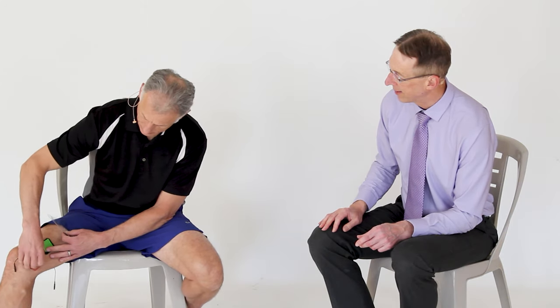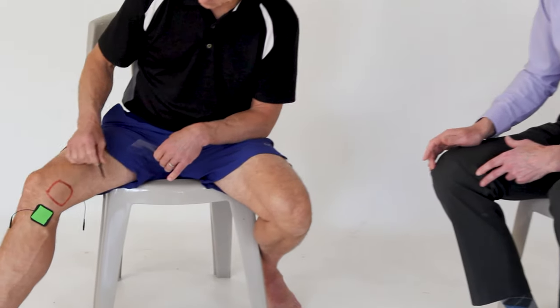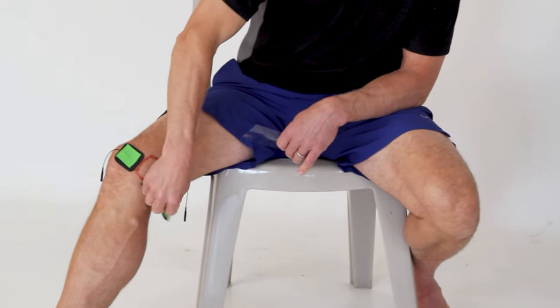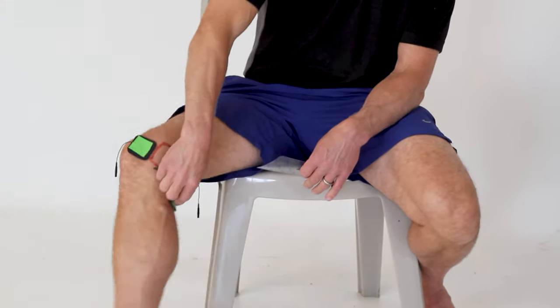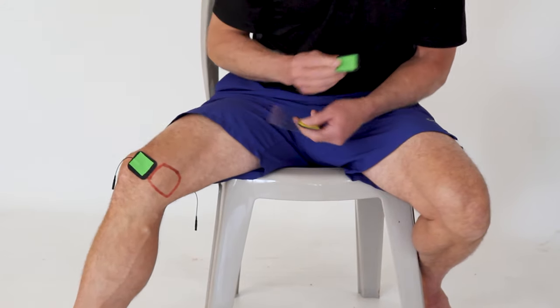Oh, this is the fun part. Pulling the hair. See the pain there. He's got one above and one below. Now, this can be a little difficult. Sometimes you can put pads side by side of the pain, but you're going to run into the kneecap, aren't you, Brad? Yeah, here and down here. When you bend your knee, you can't have this in the crux of the knee because it'll fold and conduction's not good. That's not going to work.